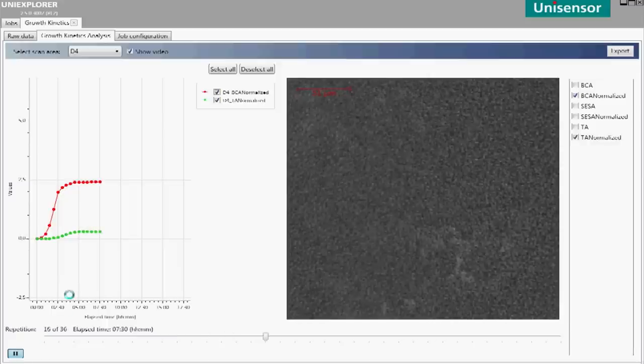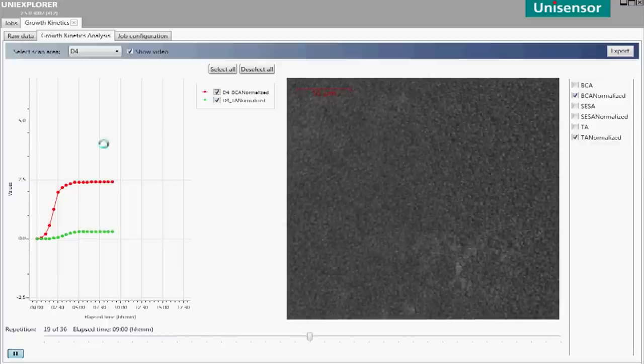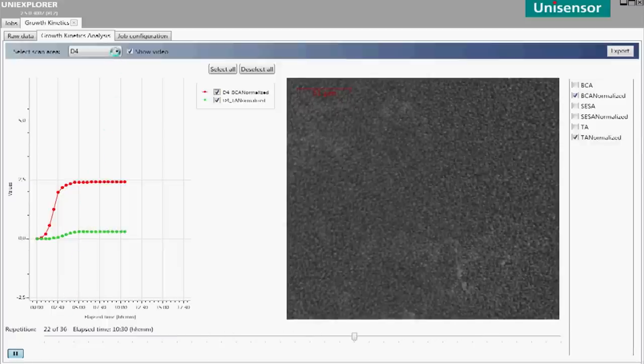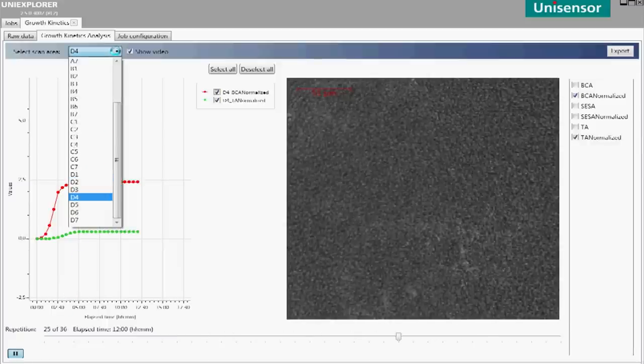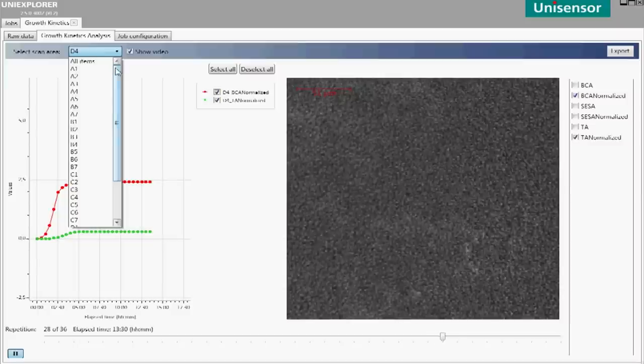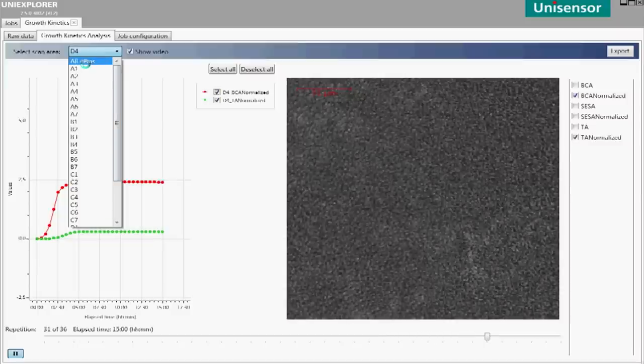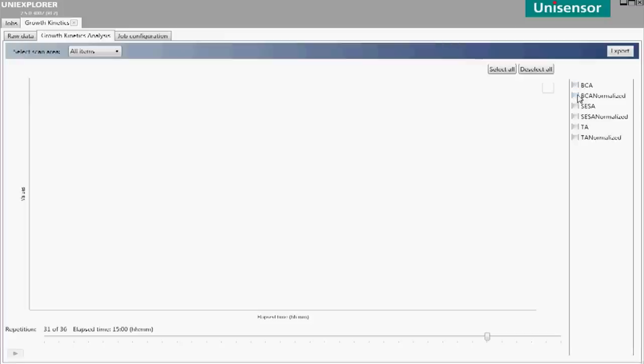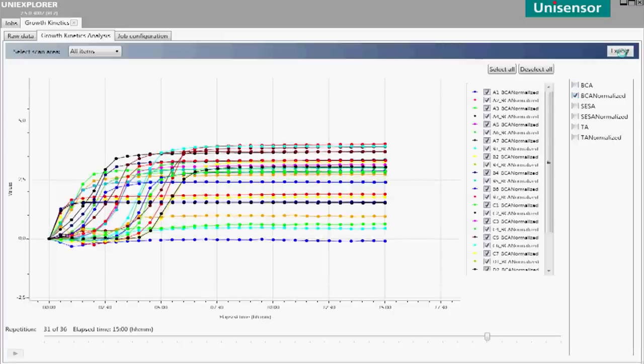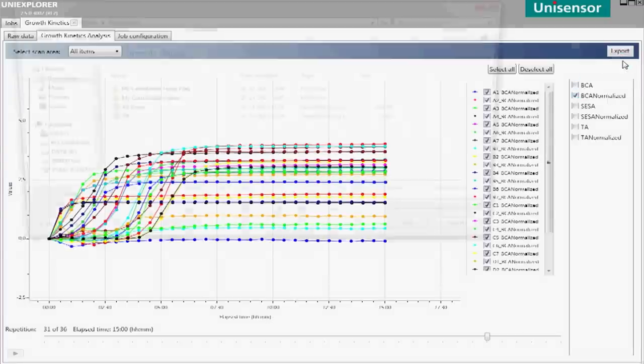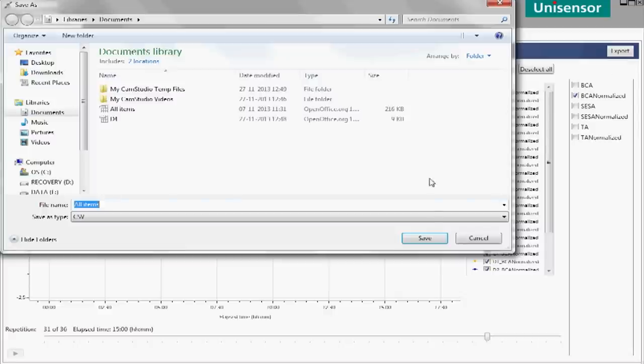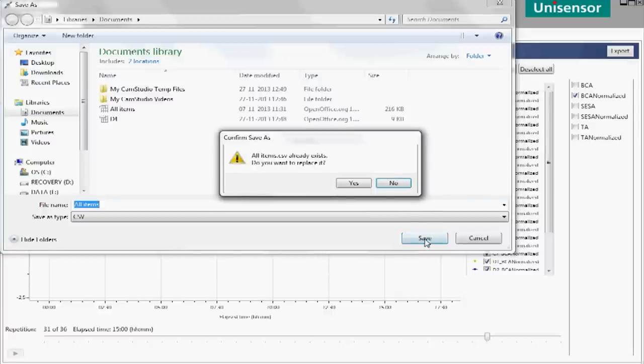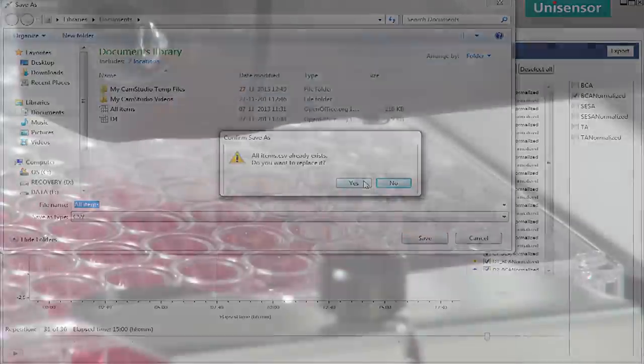When the measurements have finished, you can quickly see whether individual wells are anomalous using the Overview facility. Data from growth curves from all wells can be exported, for example in the Excel format, and video films are saved in the standard AVI format.